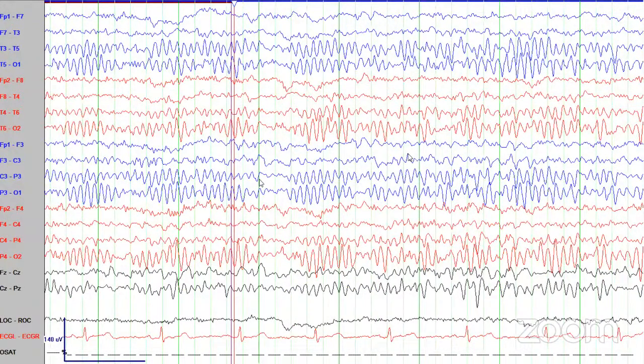That example I had put up because I wanted to show the artifacts and how they transition into sleep. However, this example is that of a normal EEG from awake to sleep transition. Here in this record, we have a well-established PDR, a nice PDR. The person has his eyes closed. It is relaxed wakefulness.